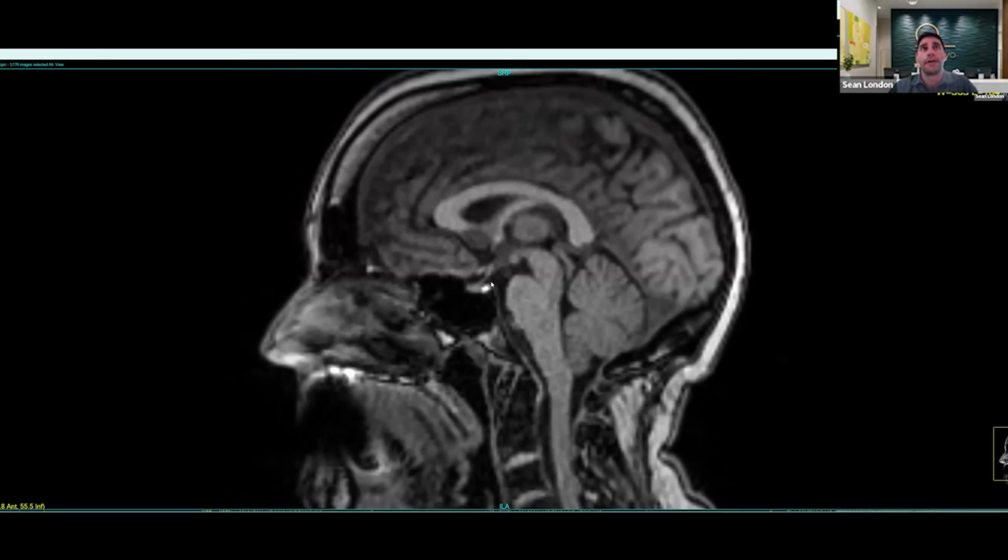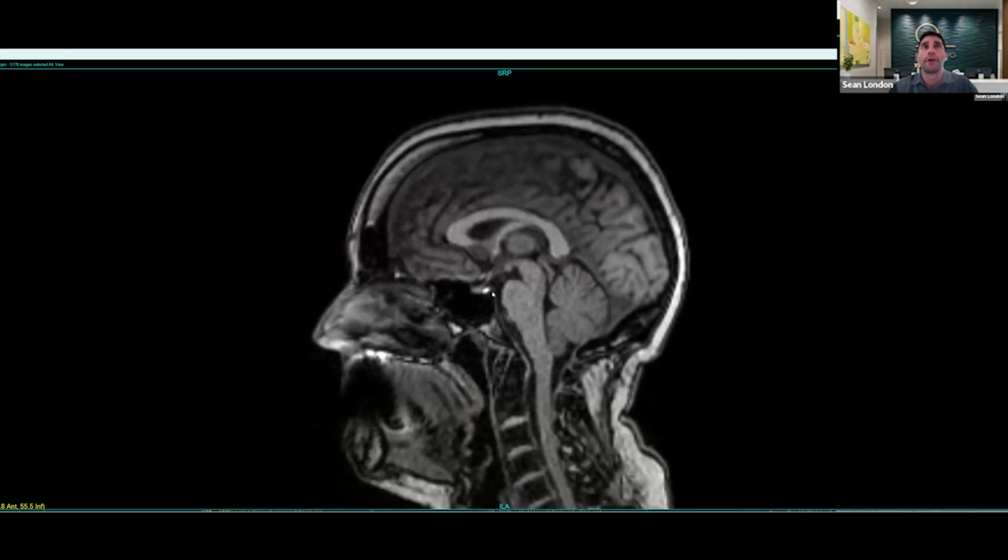For an example, in the pituitary gland, if there's a tiny nodule, generally called a microadenoma, they can be functional and secrete too much hormone. We have a difficult time detecting those on this set of exam because of the overall size, and it generally does need contrast in order to get it to stand out within the background tissue. But otherwise, this looks like a normal gland, and I don't see any concerning findings there.